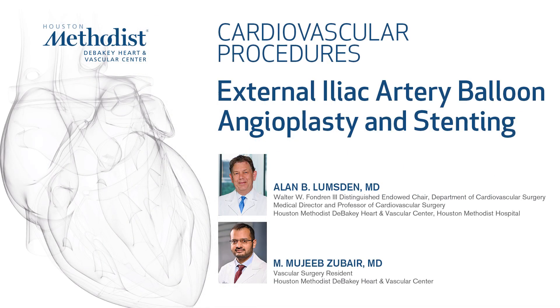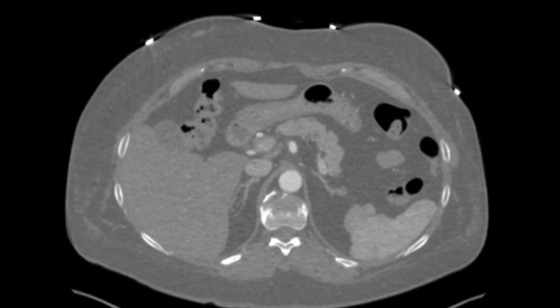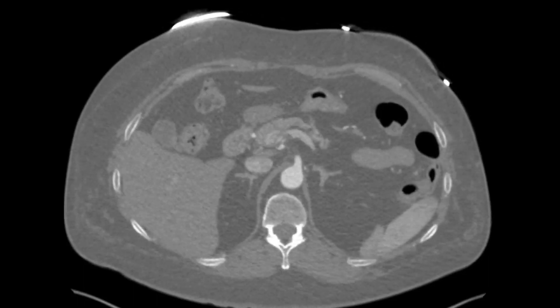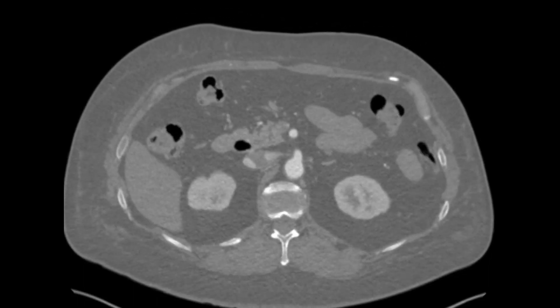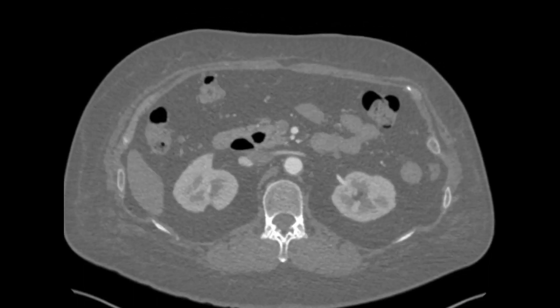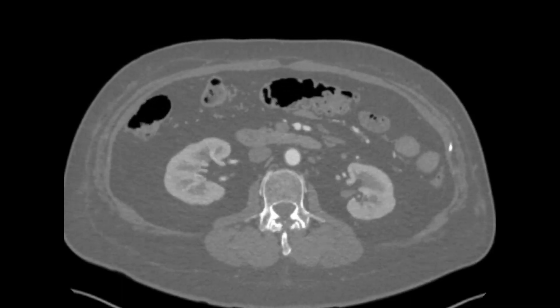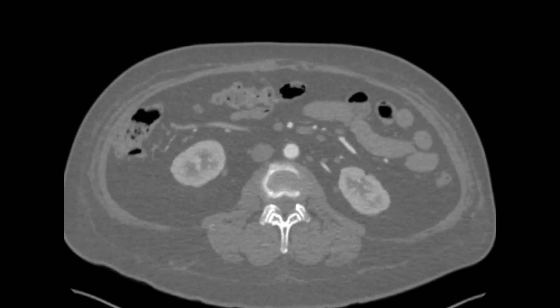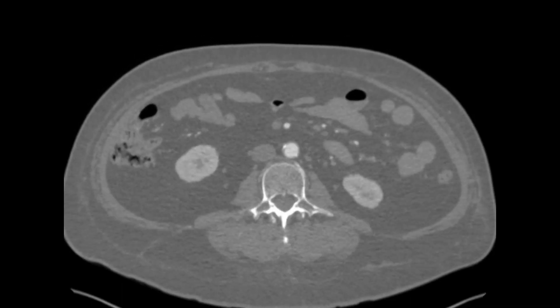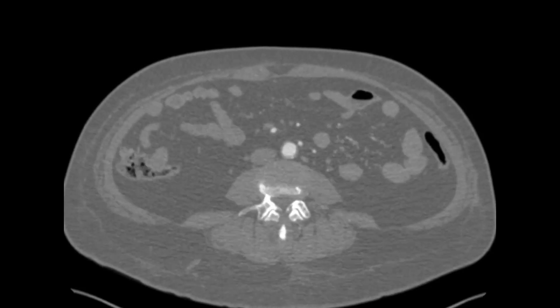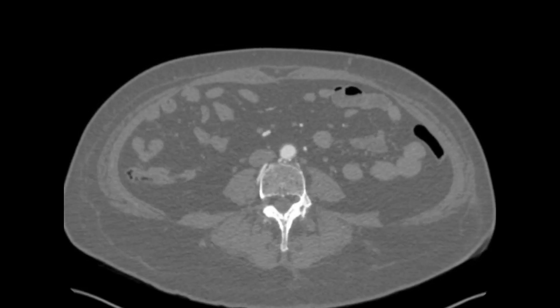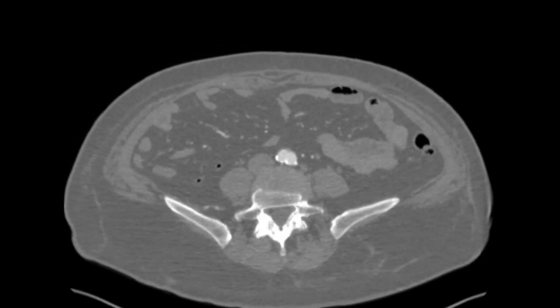This video demonstrates angioplasty and stenting of a high-grade stenosis of the right external iliac artery in a 51-year-old female who presented with complaints of lifestyle-limiting claudication. Her symptoms started right after a cardiac catheterization, and she was found to have a dissected right external iliac artery leading to high-grade stenosis.